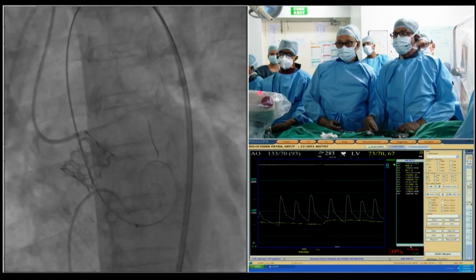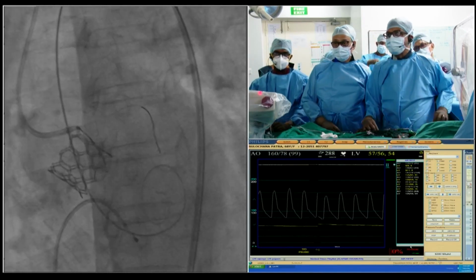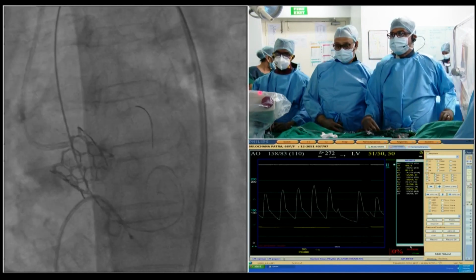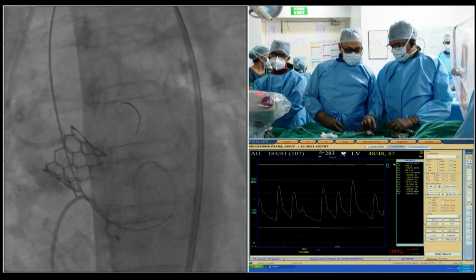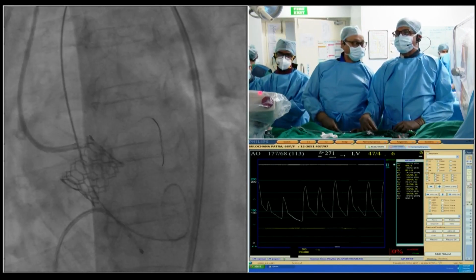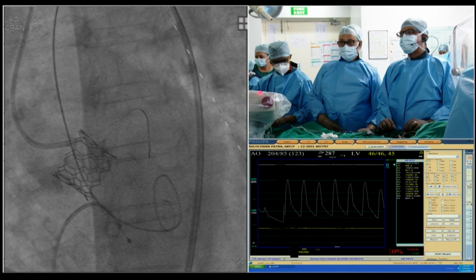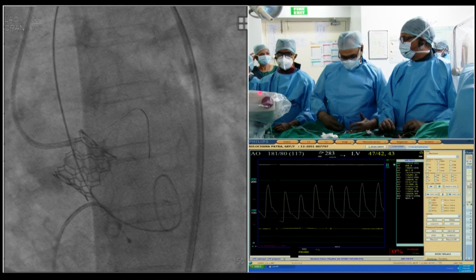Okay, small puff. So let me pull the guideliner back a little bit and advance the guide wire. Okay, that should be okay. We should be able to do LAO 40. Can you put a pigtail on this? Yes. So I'm also trying to be like Praveen and trying to simplify. Let's see if everything is good.